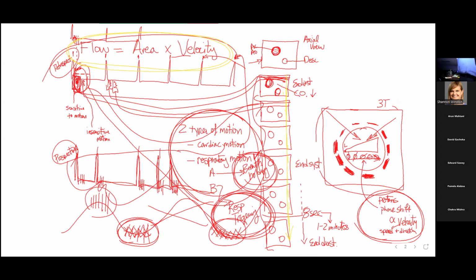And then what we're going to do is use our same old phase encoding up at the top left. But remember, our temporal resolution is cut because we're going to make one phase encode insensitive and one phase encode sensitive to flow. So we make this nice movie, and we can calculate the blood flow by looking at the area, and then we get all the velocities that are within all the pixels right inside the blood vessel. Very nice.